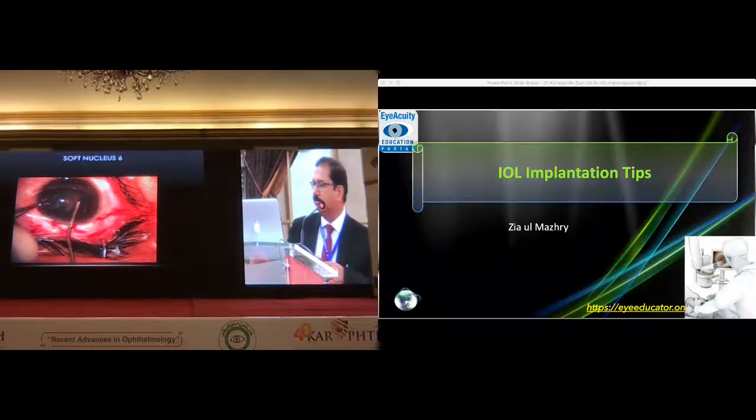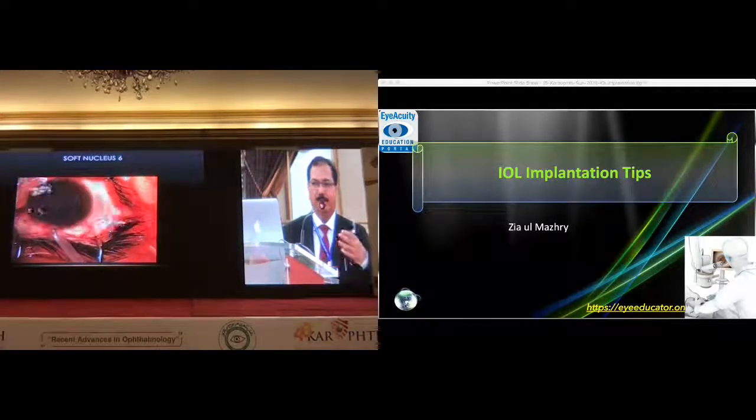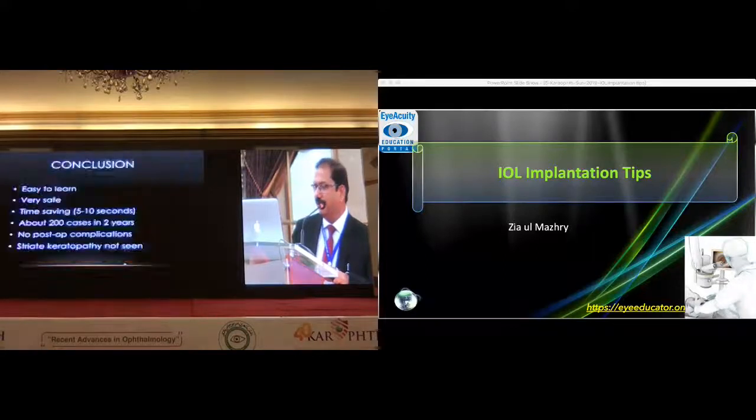It looks very good in Professor Ejala's hands. But for juniors, I would recommend that if you start bringing your nucleus into the anterior chamber, this is not an international recommendation — this is Professor Ejala's technique and it looks excellent in his hands. For a standard recommendation, the endocapsular phaco is the real answer if you're still learning. But once you become an expert and champion phaco surgeon, then do whatever you like. It's an easy technique — very easy and very safe. We are using it routinely for soft cases. It's just 5 or 10 seconds and then it goes out. There is no post-operative complication.